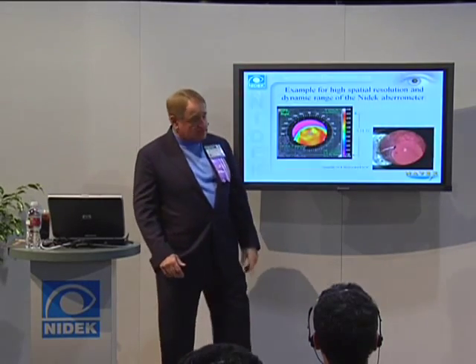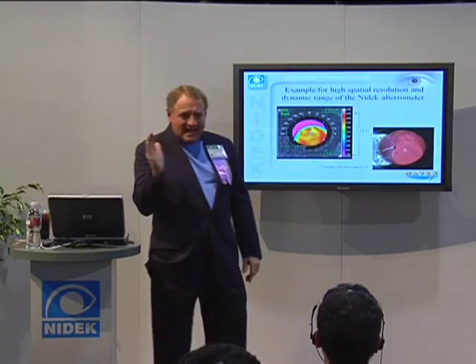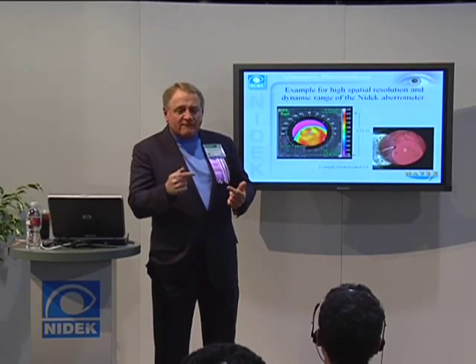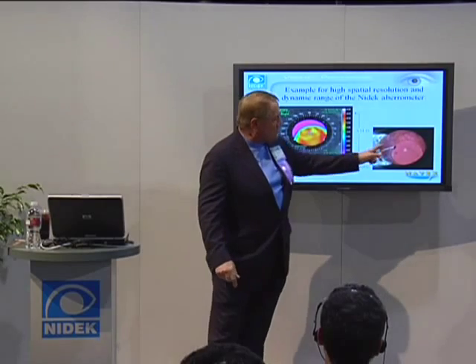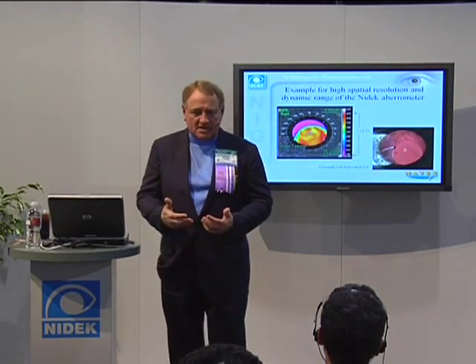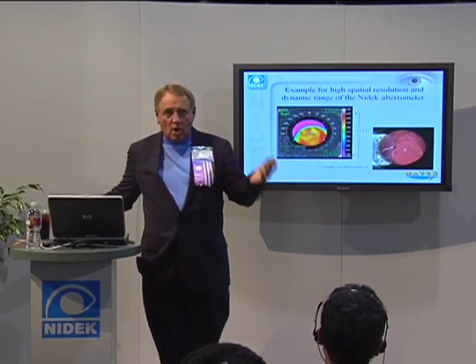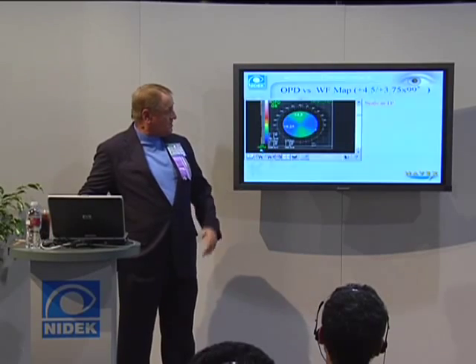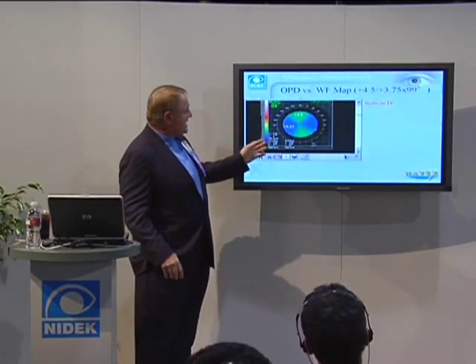But still, just like in retinoscopy, you can get an idea of a retinoscopic reflex through an opacified capsule. The wavefront measurement about the refractive error change in there, though, is going to give you an idea about the quality of vision in that patient also. So it'll help you in terms of being able to get a good refraction and determine something about a patient's eye. And again here, the point that I'm trying to make is this.